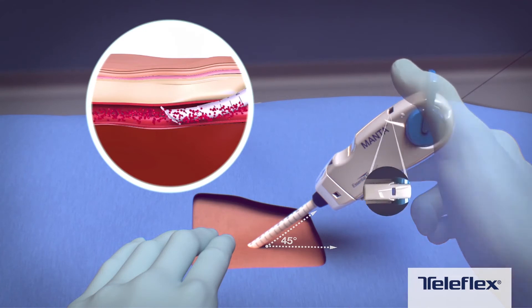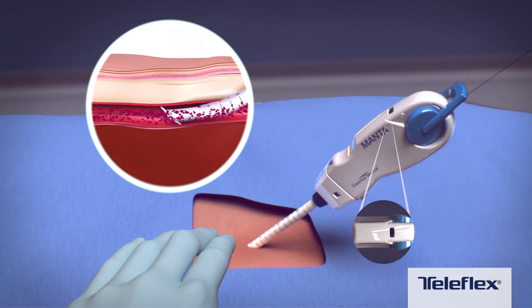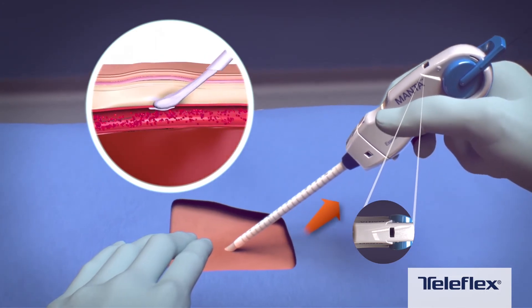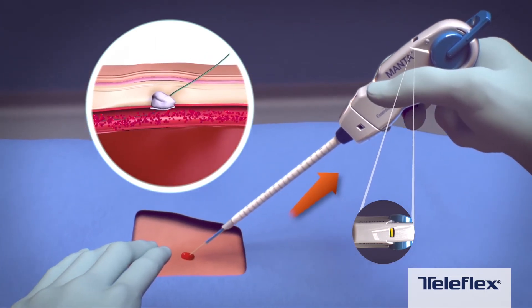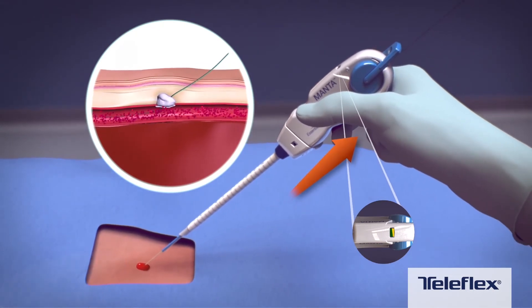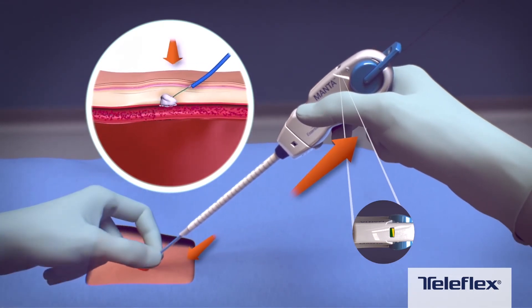Maintaining the device at 45 degrees, rotate the deployment lever to release the anchor and begin to withdraw the Manta device from the artery. Steadily withdraw the device from the artery until tension is felt and the handle indicator window shows yellow-green.